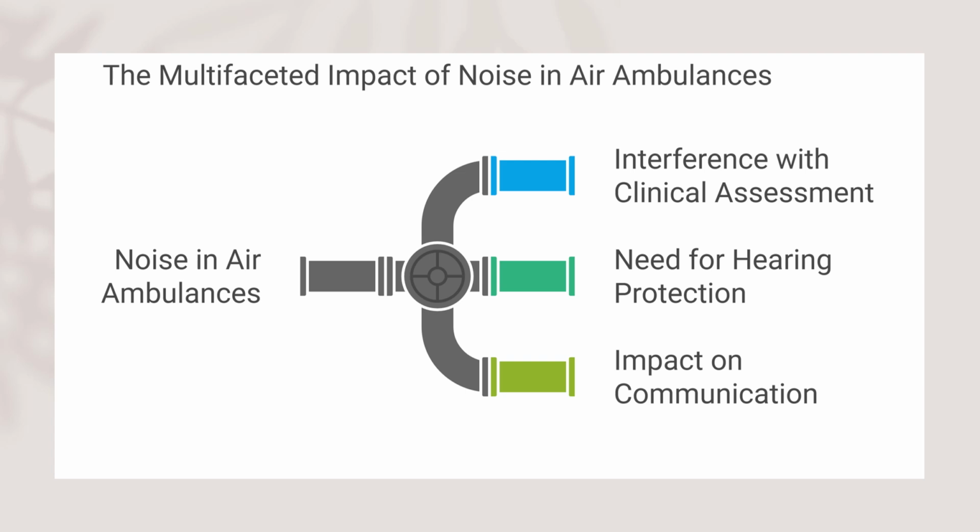We have noise in the air and in the ambulance, so we will have a multifaceted impact from the noise, and it will interfere with the clinical assessment. Also, we need hearing protection, and at that time we should watch the alarm on the console of the intra-aortic balloon pump and the alarm on the monitor if we can't hear or tolerate the noise. Also, we should have a clear way of communication between the medical team and the captain. If we can't hear each other, we should have another way of communication to avoid any complication.